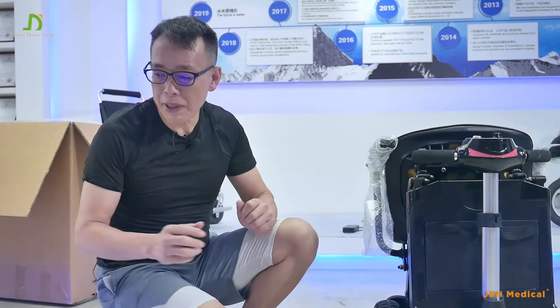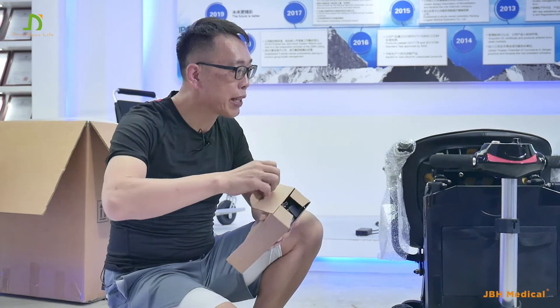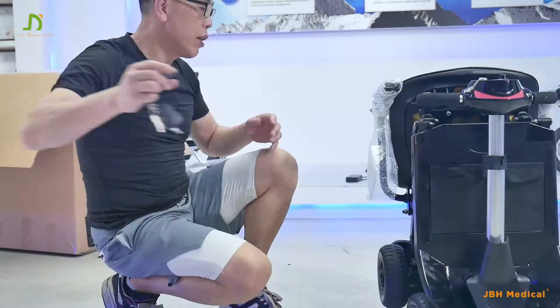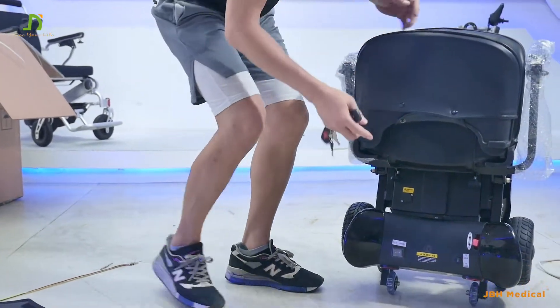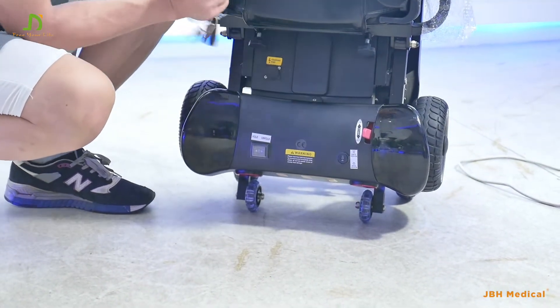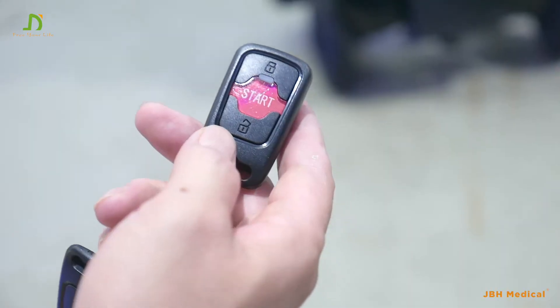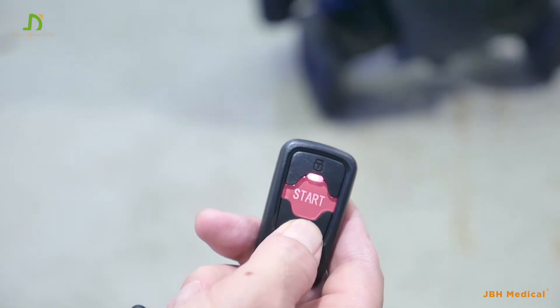When we set the battery, we can actually open the scooter by remote control and the key, which are right in the box of the charger. Make sure there's a switch here — turn it to the remote control function.